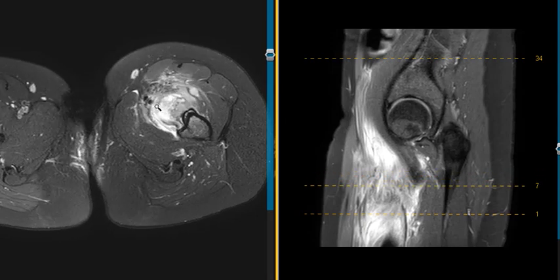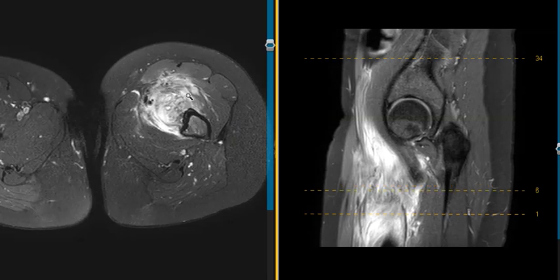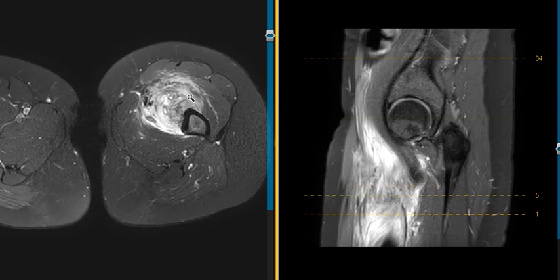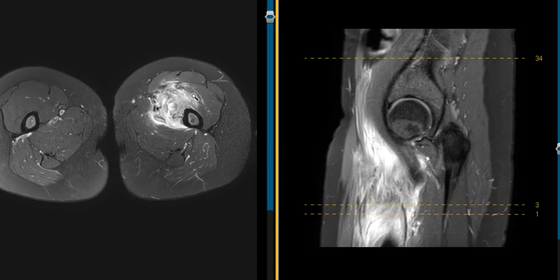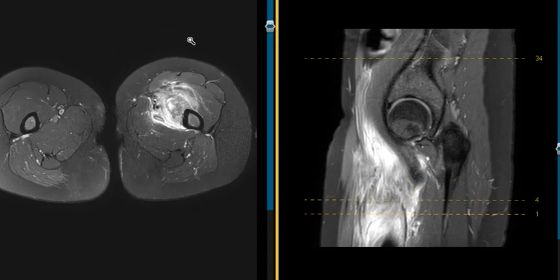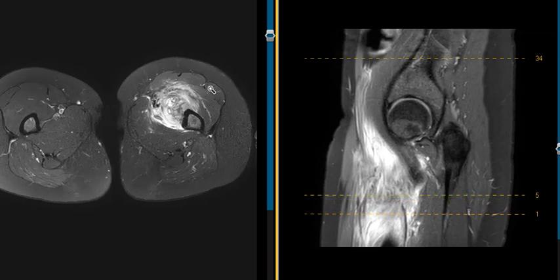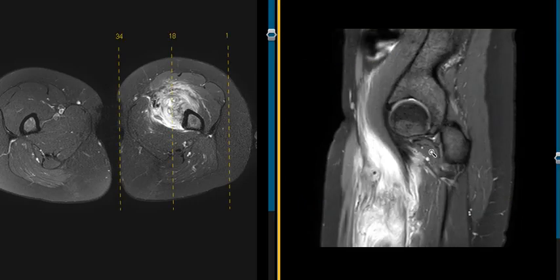This rounded area right here is probably an area of prior hemorrhage and ossification. It can look exactly like a malignancy, and even when they do biopsy, it can seem like a malignancy. So again, this is probably myositis ossificans circumscripta.